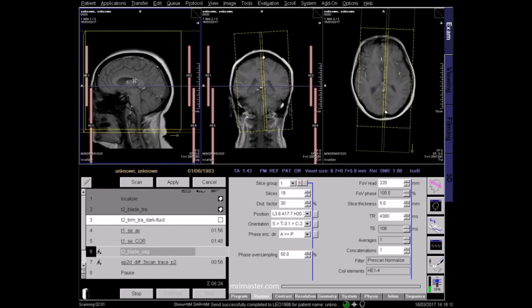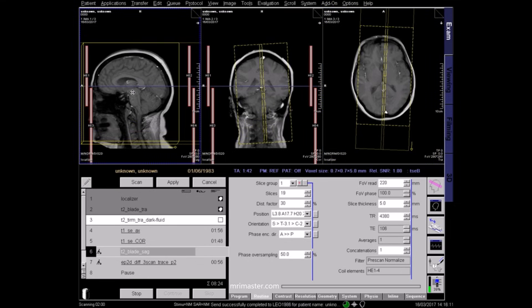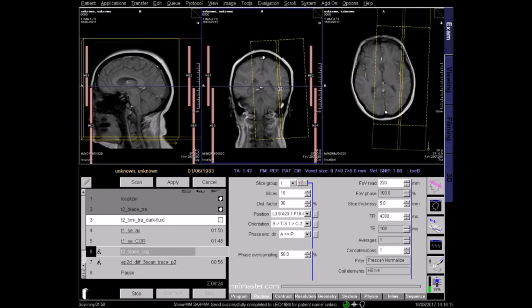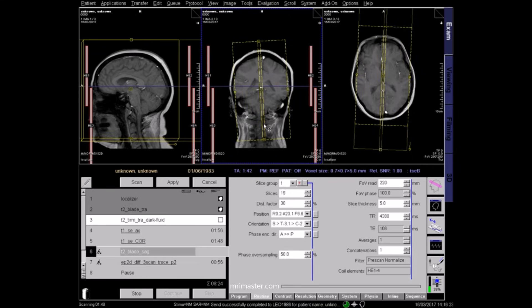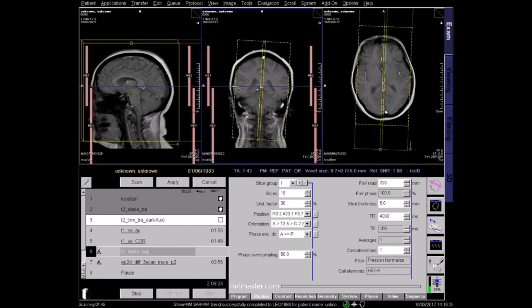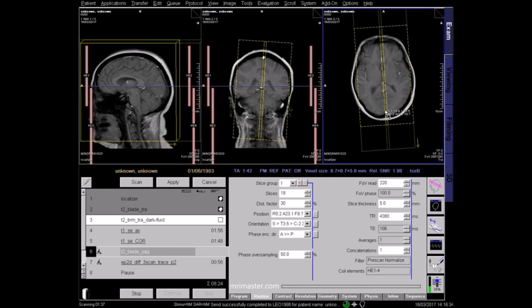Plan the sagittal sequence. Make sure you cover the full width of the brain from side to side. Center to the midline on the axial view, and again cover from side to side.